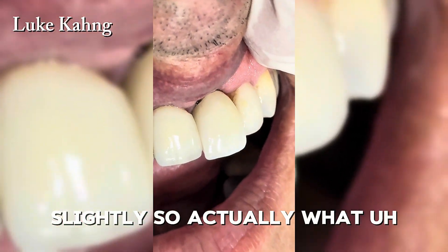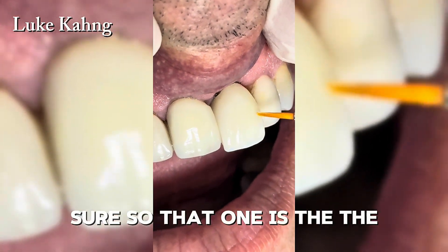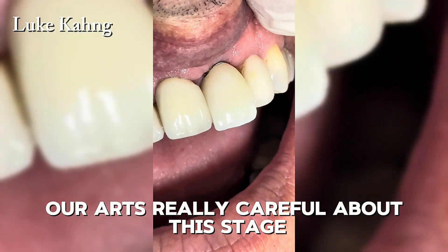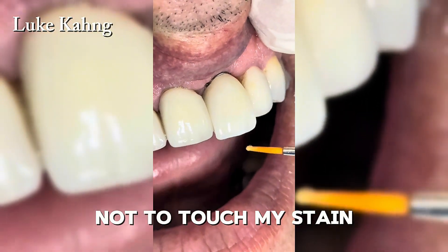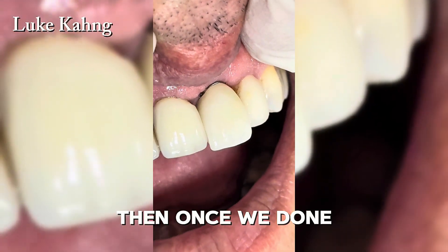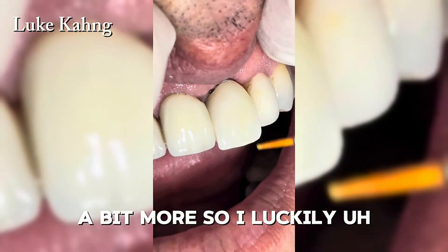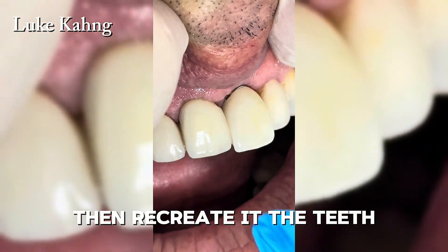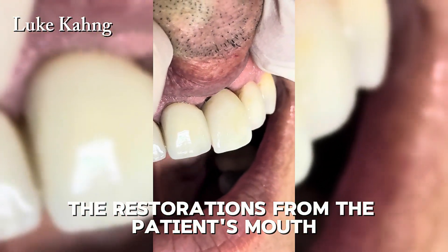The gingiva and body are a little different all the way to the incisor. At this stage, you really have to be careful — after staining, a lot of people ask about this. Be careful not to touch the stain. Make sure the incisor area is checked too. Luckily, the adjacent teeth are fake restorations, so there is no dehydration problem.